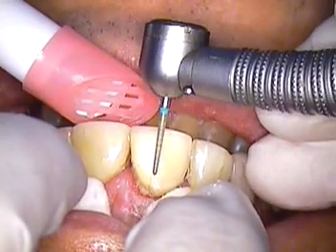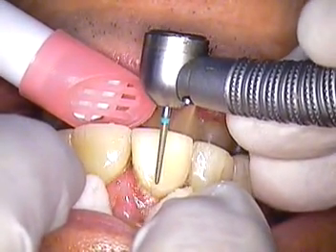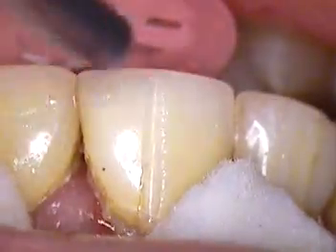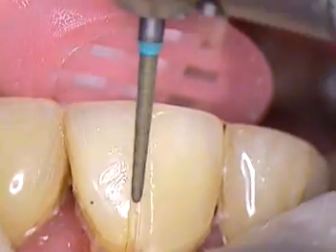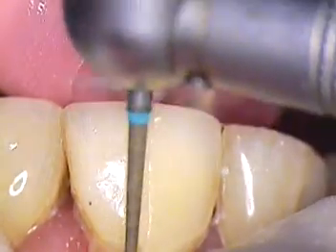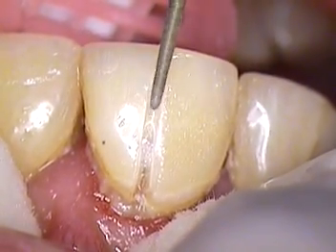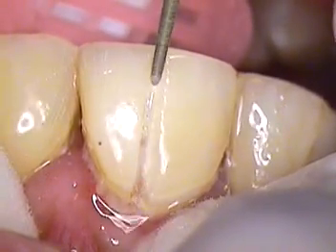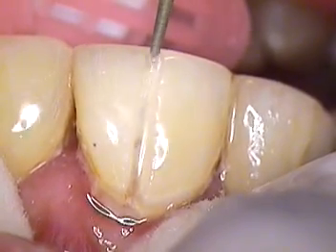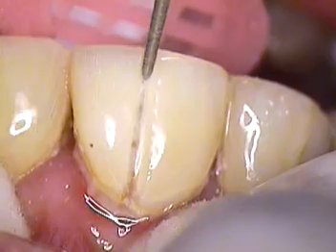All right. So we're just going to go through our provisional. And let me get some water on here. And we're going to zoom in. Try to keep our preparation in 3 dimension. And there's our cement layer. Appears to be some type of clear cement that was used with some opaque modifiers. It was reported that originally the veneers were made and no provisionalization was accomplished, so we're going to go ahead and provisionalize that today.